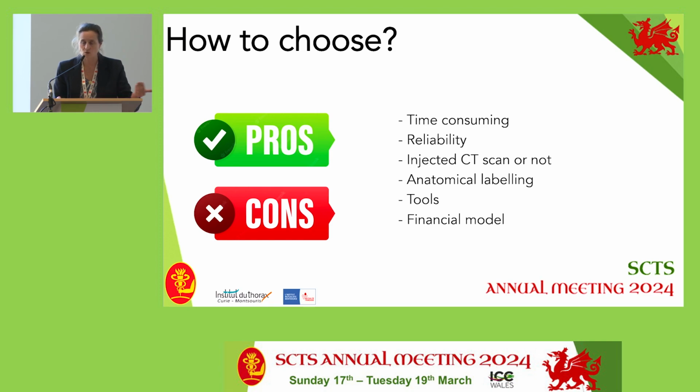I mean, you have some pros and cons, so it could be time consuming if you are doing your own 3D reconstruction with your 3D console, and it's also time consuming for your radiologists when you ask them to do it for you. That's what they say to us. You need to find a way to be very confident with the model. You need also to think about injected CT scan or not.